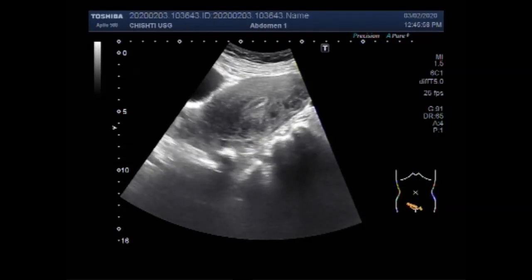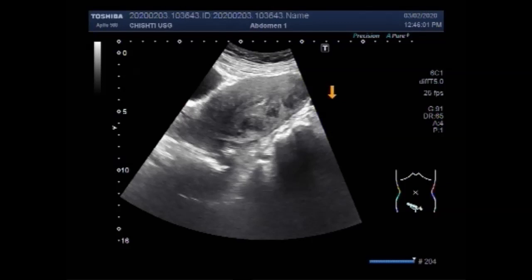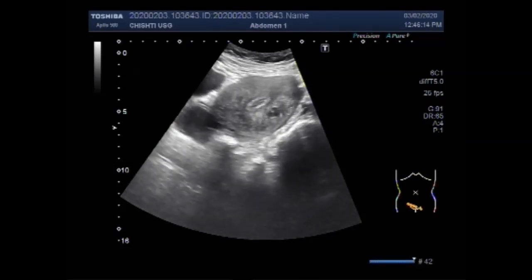Now again you can see these multiple fibroids. These are semi-solid to solid in consistency, with homogeneous, equal texture. No significant blood flow is seen in their interior.